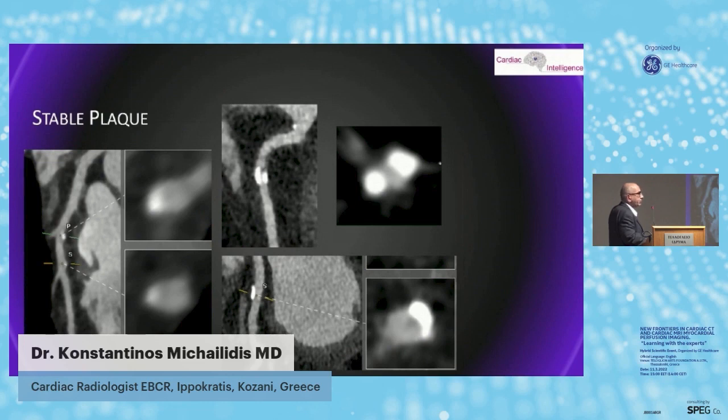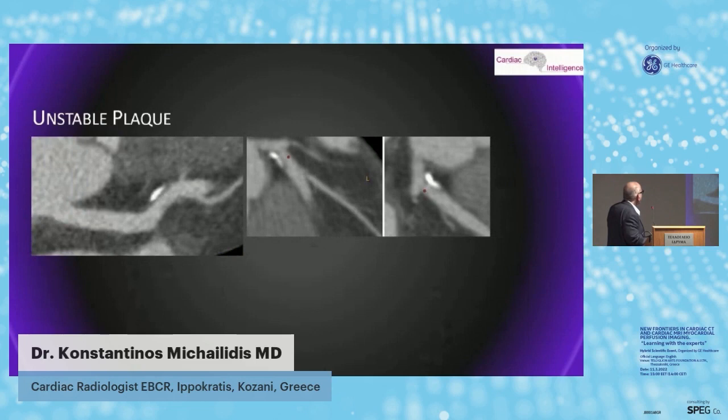This is not the reality. We'll have to change the window. You can see that finally the lumen is much better than this. Of course there is a stenosis here, but it's non-critical. And here you can see a plaque, this is the remodeling that you expect if everything goes well. Something like this, an oval-shaped plaque that barely produces any stenosis.